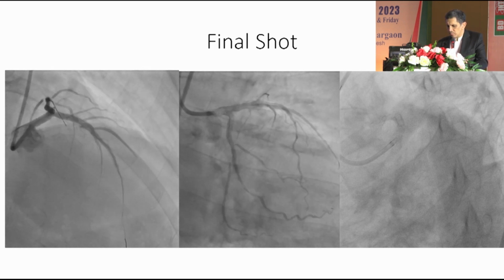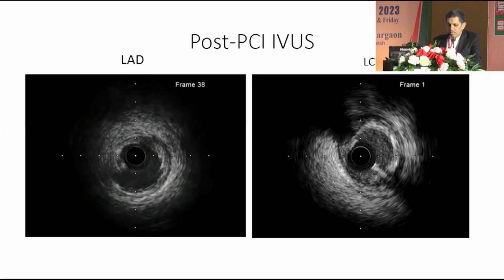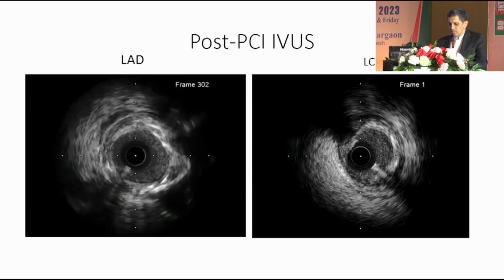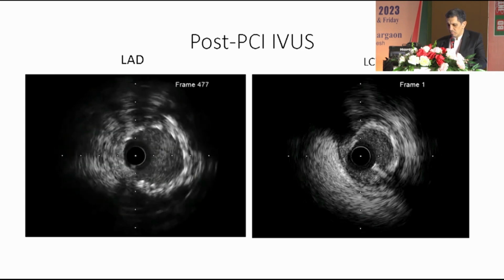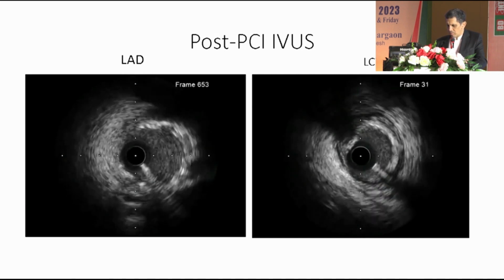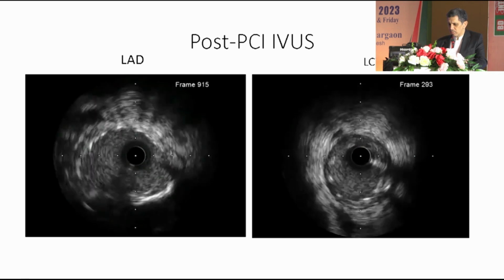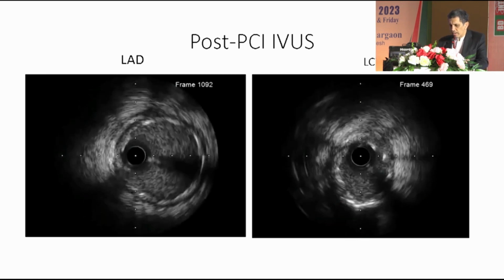So the result is very beautiful. Looks like a well expanded stent. And this is from the LAD post IVUS. The stent expands well. And then there's our circumflex as well. You can see, appreciate here, the stent. So let's focus on the IVUS from the circumflex.